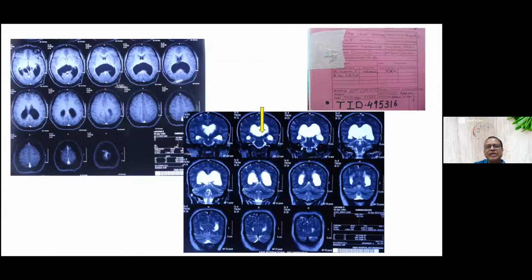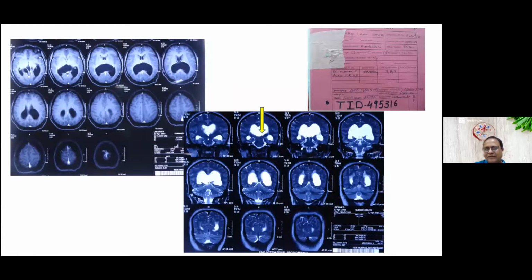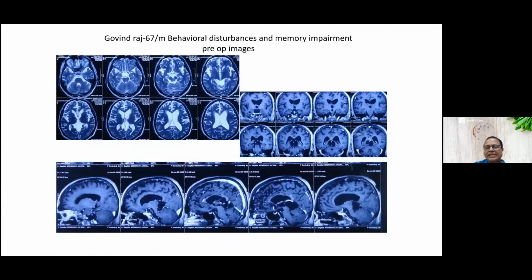interpositum cistern. So whenever the diagnosis is an interpositum cistern cyst, or the vein is displaced inferiorly, it is better to do it through the lateral ventricle. But in a case like this, where the vein is pushed superiorly, probably doing it through the infratentorial supracerebellar, endoscope-assisted approach is better. When you do it through the lateral ventricle or the third ventricle, we might encounter veins, and this was the mistake we had made. I had to do a cystoventriculostomy through a very narrow space, and I was very afraid to do that.